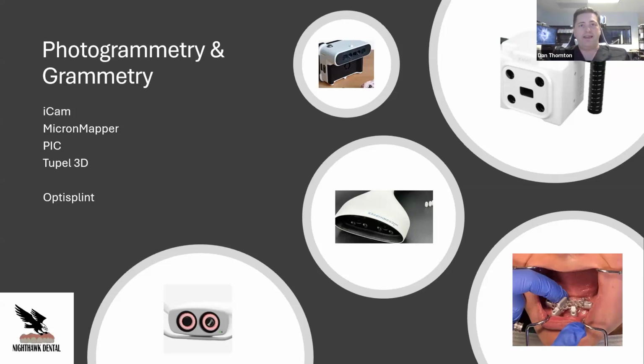Now, with that said, you can actually do the 100% digital workflow with 3Shape or exocad. Which one do I prefer? That's a whole different story. I like both. It depends on what I'm doing with it. I actually run with both systems.